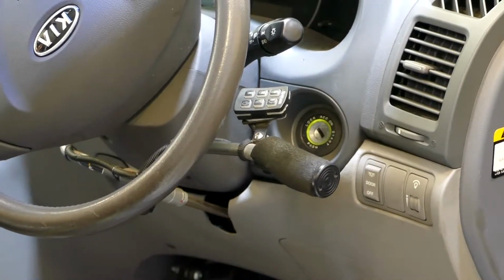The majority of people can just use a generic hand control. If the person has all four limbs involved related to their disability or injury, then it's a little bit more complicated in how you need to set things up. Somebody that has a tetraplegia, as well as fitting the hand control into the vehicle, we'll be looking at all the secondary controls, how they're going to manage the indicators and the dashboard controls and the gear selector and starting the vehicle and stuff along those lines. And so depending on that individual's abilities and the specific vehicle that's chosen, we then need to work out solutions for how they're going to manage everything and be independent.